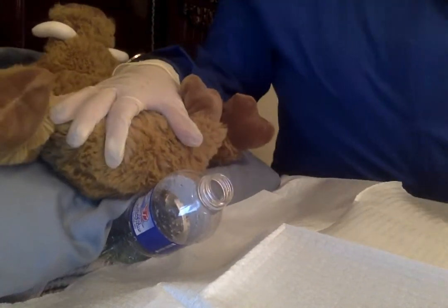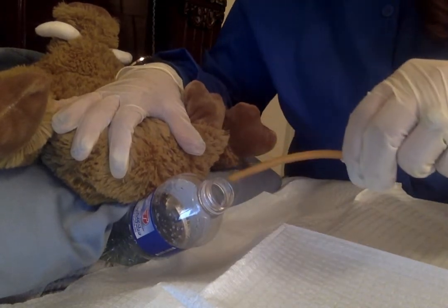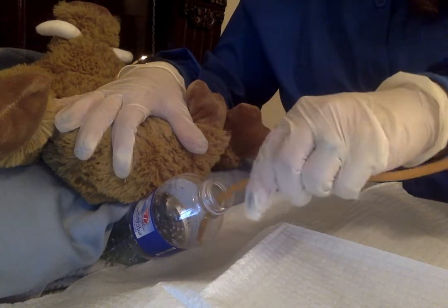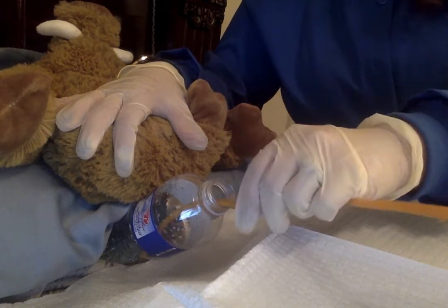So since we've already lubed up our catheter, now we can insert our catheter. Inserting, pulling our hands back, inserting, pulling our hands back, inserting, pulling our hands back.